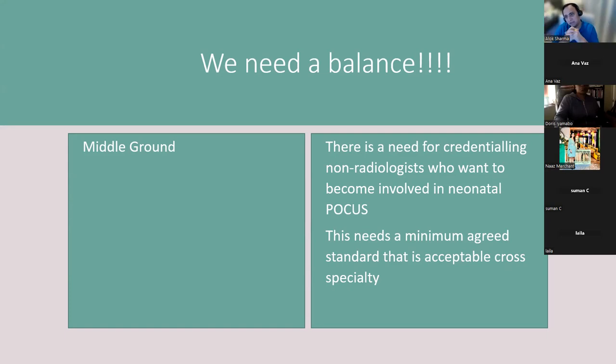I know that in the Australian Society of Ultrasound Medicine, they're quite happy for us to do about 25 lung ultrasounds to start and then do a further 25 to credential into advanced lung ultrasound, which is 50 lung ultrasounds, without specifying a period over which it's done. But they feel that 6 months to a year is good enough time to achieve that. So you do a face-to-face course, you do those lung ultrasounds, they're reviewed by a master trainer, they're signed off, you keep a logbook, and actually you're good to go in terms of performing point-of-care lung ultrasound. That would be their accreditation, which is then acceptable to the Australian Society of Radiology, which has been agreed as a standard. Unfortunately, for the UK, there is no such standard.